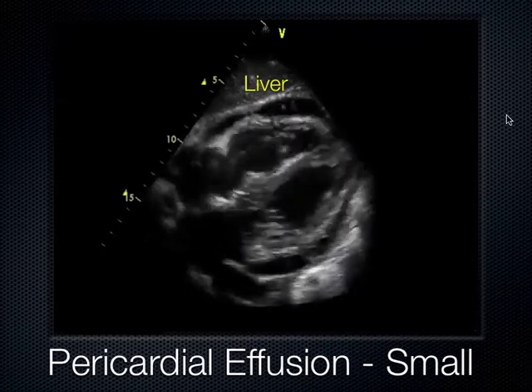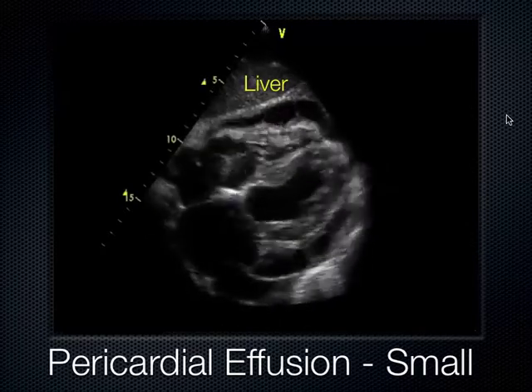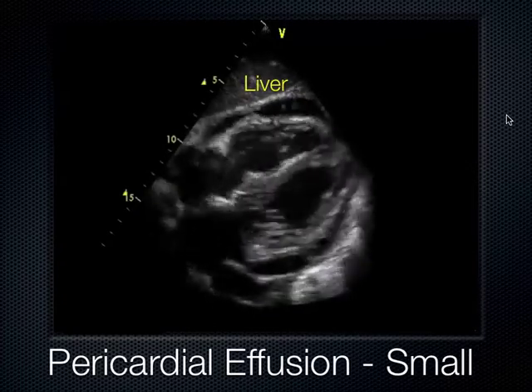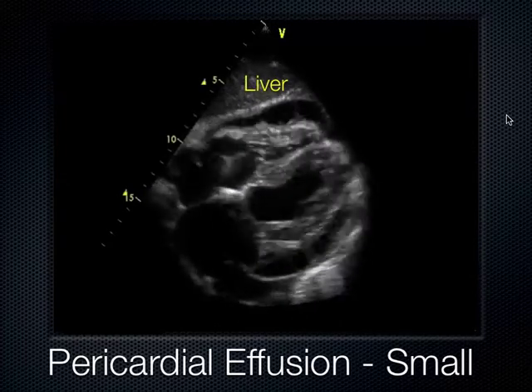To really decide that, you'd probably need to do some kind of volumetric scan of the heart in 3 dimensions, and then take the area under the curve using calculus or something that I don't know anything about. So the answer is I don't know.